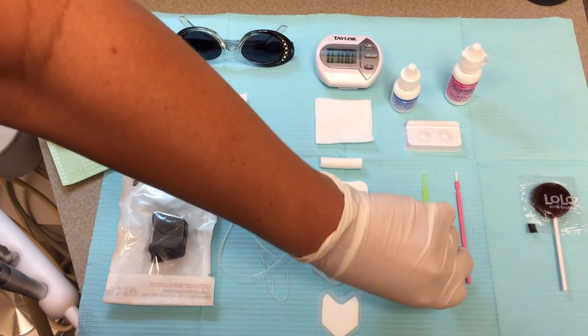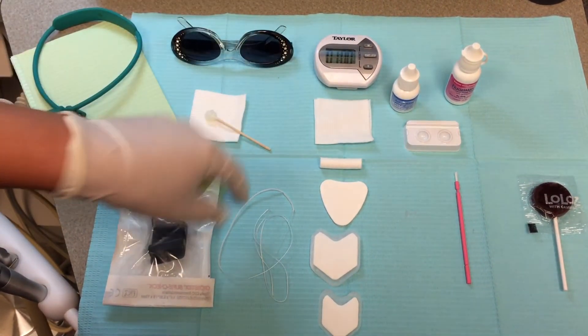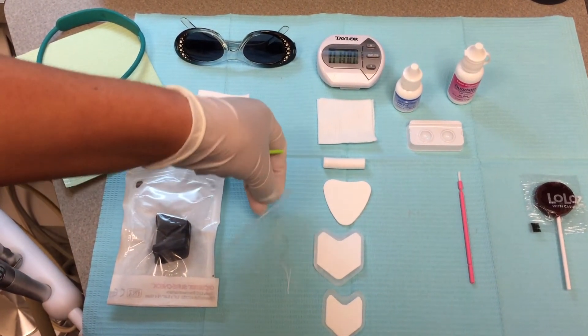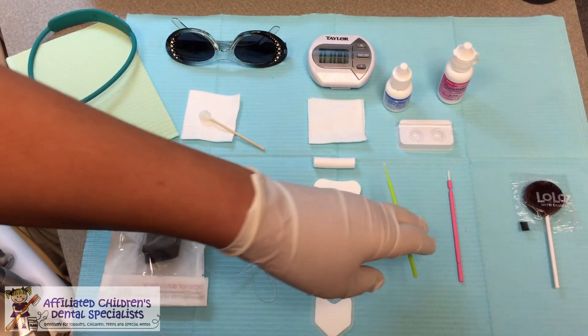I apply it with a little fuzzy micro brush — just a regular micro brush is all I use. This is probably because I do a lot of interproximal lesions with the super floss, and I find that other brushes were snagging the floss. So just a fuzzy micro brush works great.